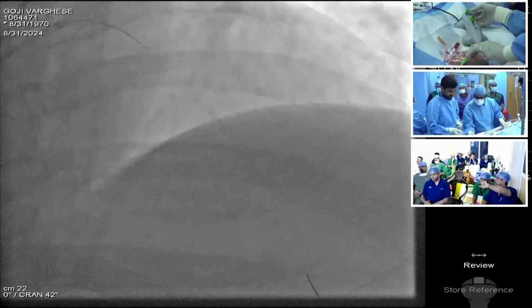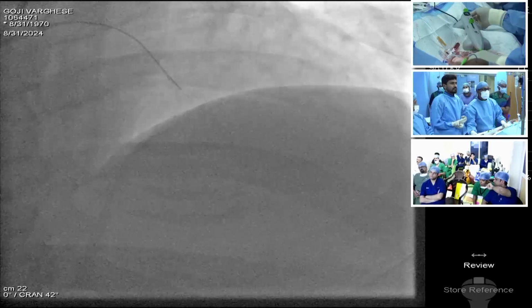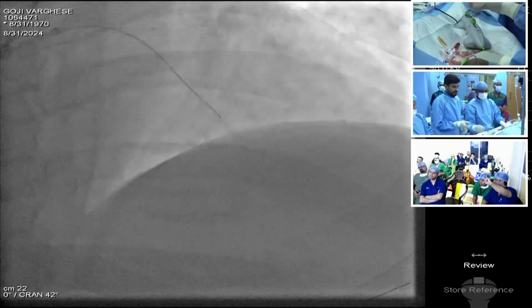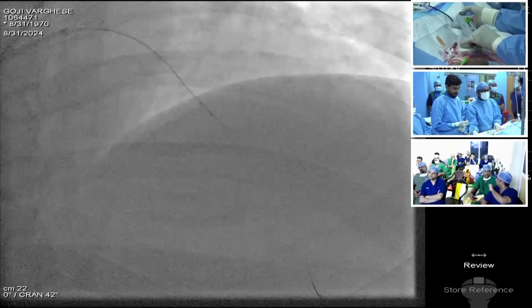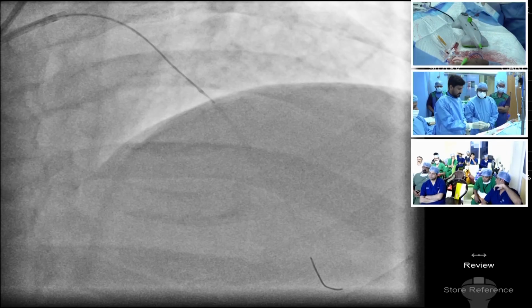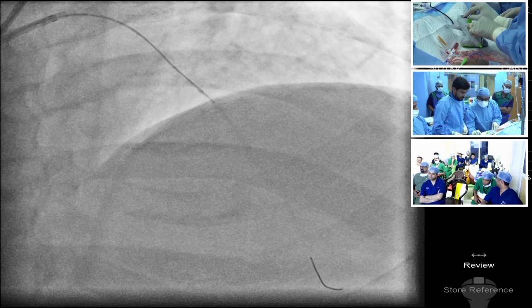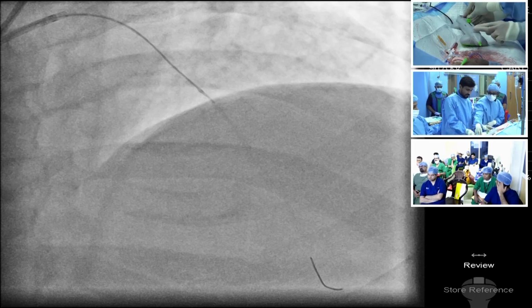Yeah, we'll again unlock it. Okay, there. We'll have the wire. Okay, then we'll have the break. Now that area appears to be more of here. We are actually going to low speeds, 80,000, because... okay.